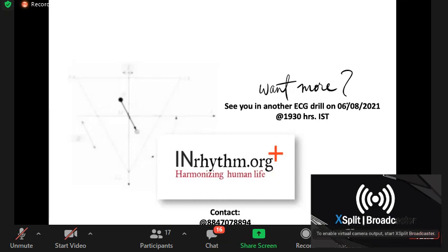Suppose you are dealing with a patient with a fixed PP interval, and then you don't see any atrial activity, I mean an isoelectric line. That means there is no impulse generation from the SA node. Now, some electrophysiologists or authorities say when you don't have a P wave for 3 seconds, I mean the RR interval is 3 seconds, then you call it a sinus arrest. But whether that is a sinus arrest or a sinoatrial exit block 3, that is meaningless. Whatever we are dealing with is an advanced sinoatrial exit block or SA arrest.